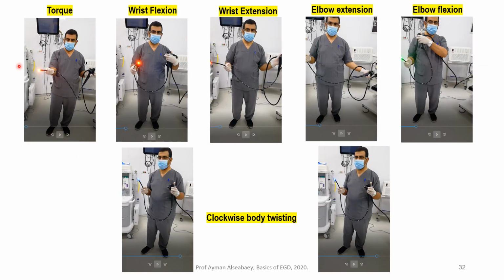Number one, look to this slide. The most common movement used during endoscopy is movement toward the right or towards the left. I will catch the shaft or the body of the endoscope 20 centimeters from the distal tip here. While catching it, try to rotate the shaft clockwise and try to rotate the shaft anti-clockwise. And look to the screen. Don't look to this endoscope, look to the screen.